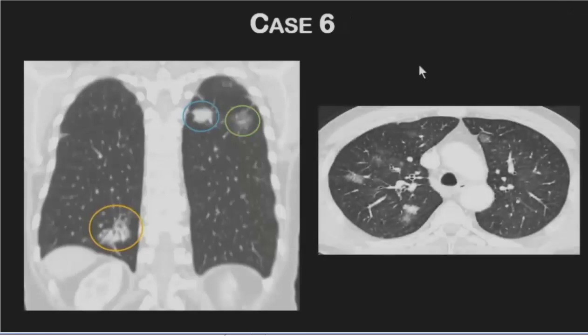And here we have another example of several adenocarcinomas. So hopefully you would not be asked to biopsy all of these lesions, but that you could tell them that this was most likely going to be several different adenocarcinomas, and that could be left alone.